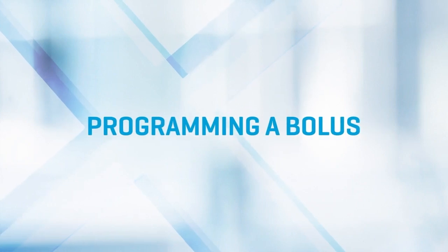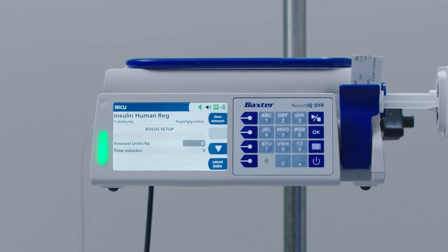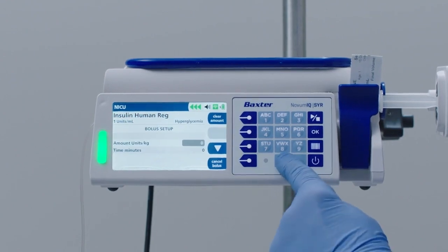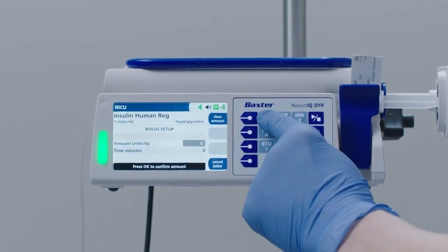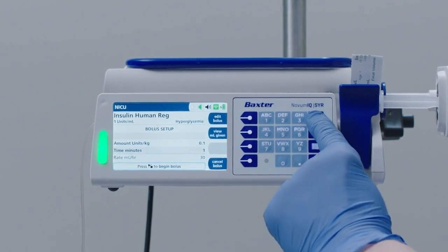Programming a bolus. Next, you will be programming a bolus by pressing the Bolus soft key and entering the amount of 0.1 units per kilogram. Press OK. Enter 1 minute and press OK. Press Run Stop to begin the bolus.